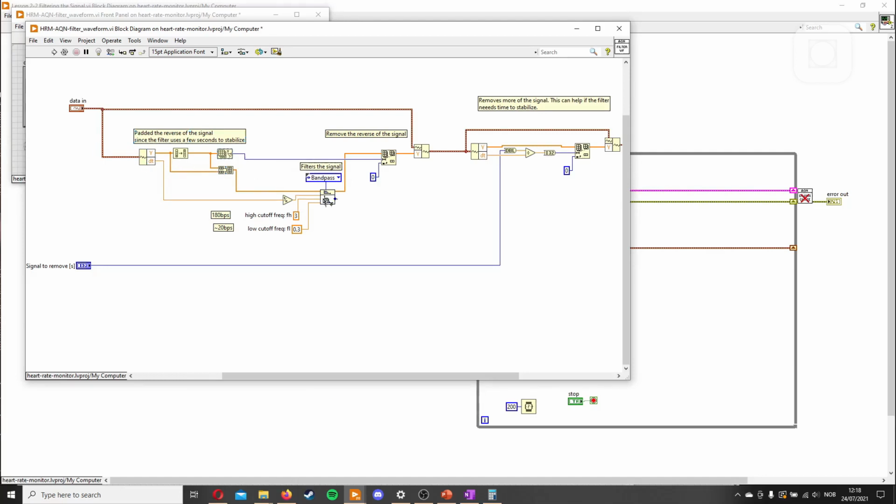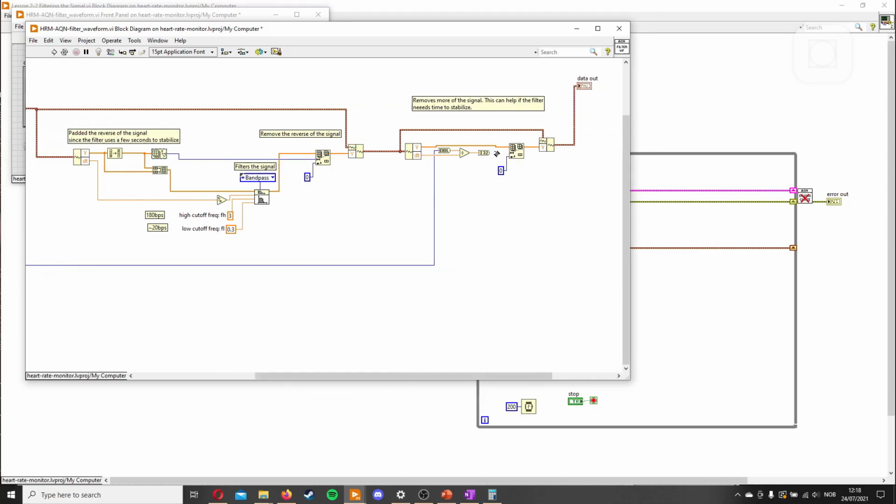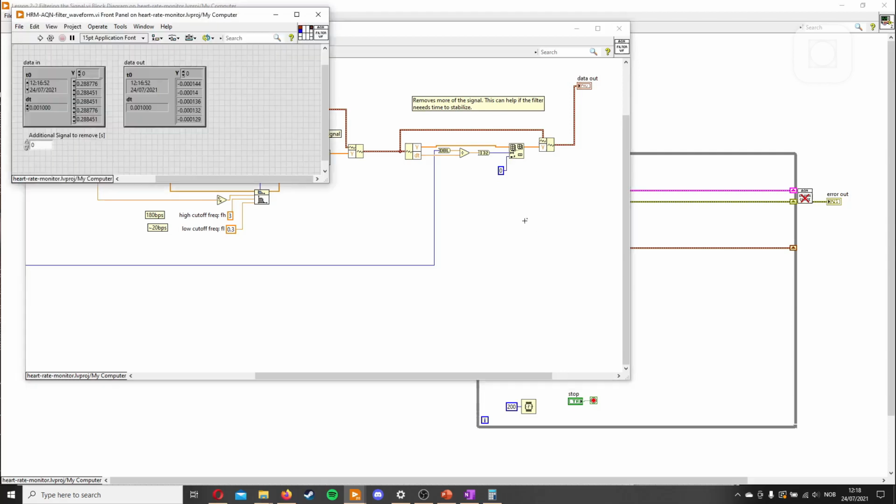So we pad the signal with its own signal, just reversed. We put that through the filtering, and I filter it between 180 and 20 beats per minute. Then we remove the padded signal, the extra signal with the stabilizing part in it, before we place it back into the waveform. And after that, we have the option to remove part of the signal. This might be unnecessary now, but I've noticed sometimes there can be parts of the signal you want to remove anyway, so that's why I added it.